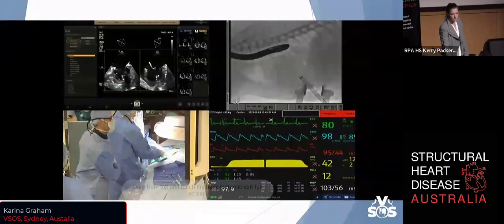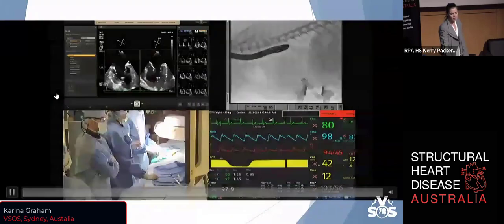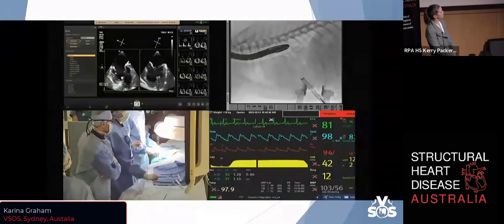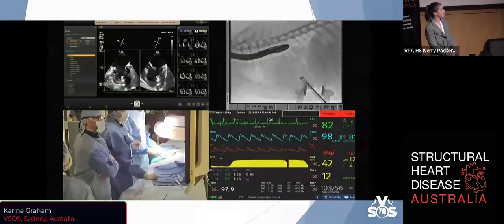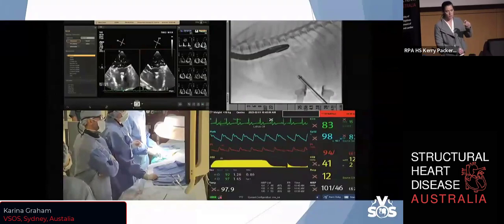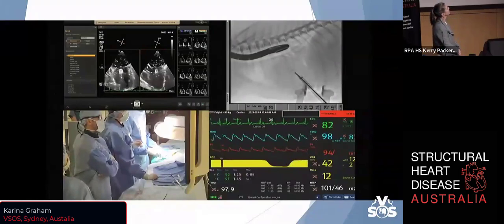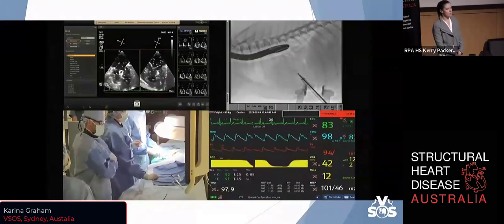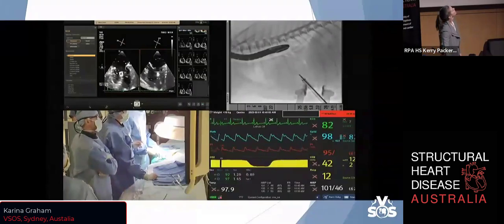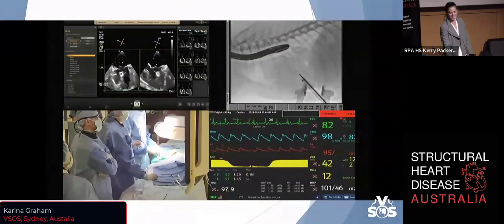So this is a little procedure that's nicely presented, which I thought I'd take from Colorado. The procedure is transapical. The sheath is 16 French. Dogs seem to tolerate the transapical really well. And they have a little mesh ball that's being advanced there into the LA over the mitral apparatus. Don't worry about the bubbles. Our patients don't have to spell their names, so we get away with that.